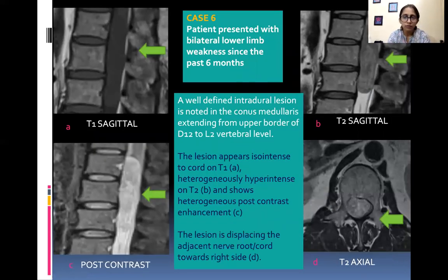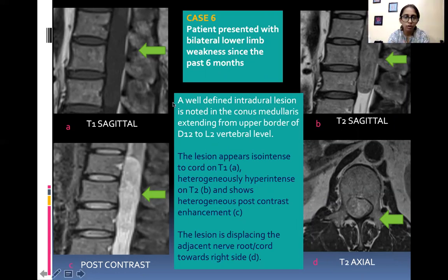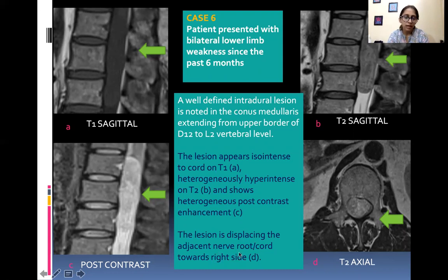Presenting a case of neurofibroma: patient presented with bilateral lower limb weakness since six months. A well-defined intradural lesion is noted in the conus medullaris, extending from the upper border of D12 to L2 vertebral level. The lesion appears iso-intense to cord on T1 and heterogeneously hyper intense on T2, and shows heterogeneous post-contrast enhancement. The lesion displaces the adjacent nerve root and cord towards the right side.